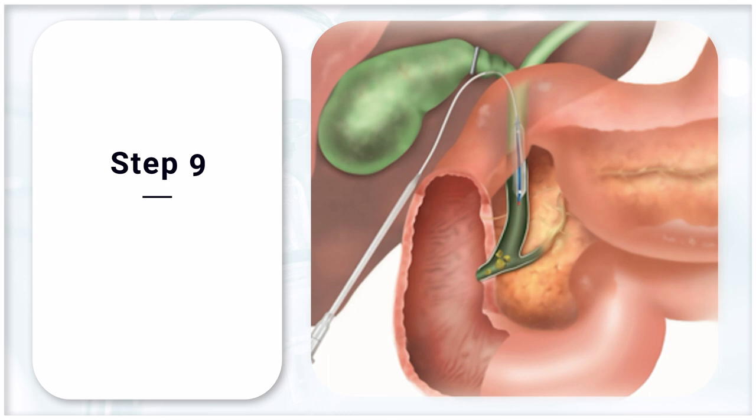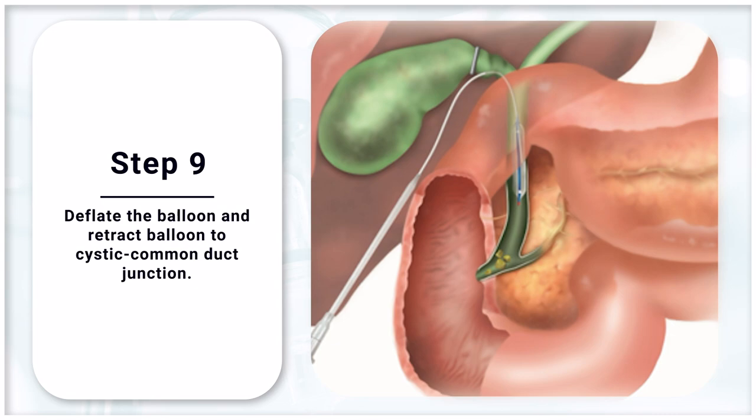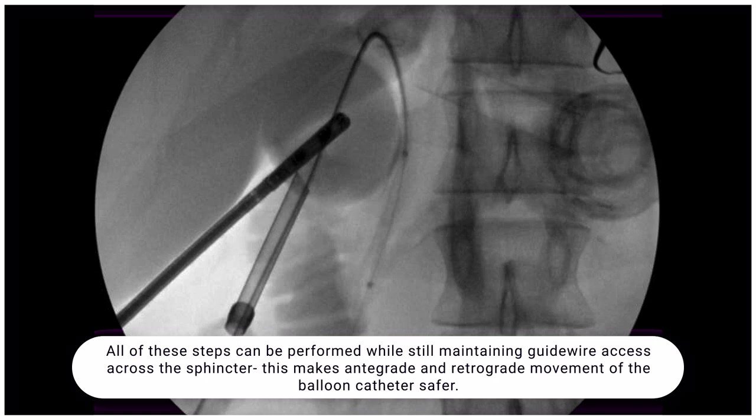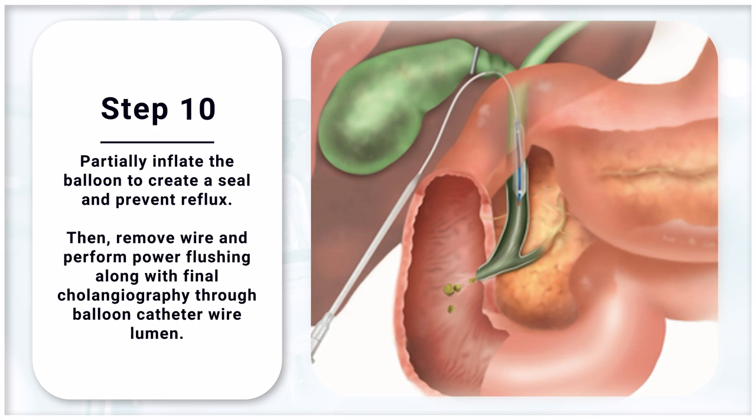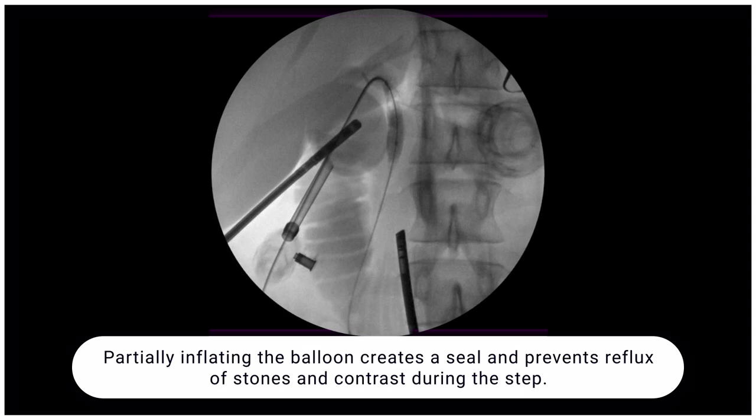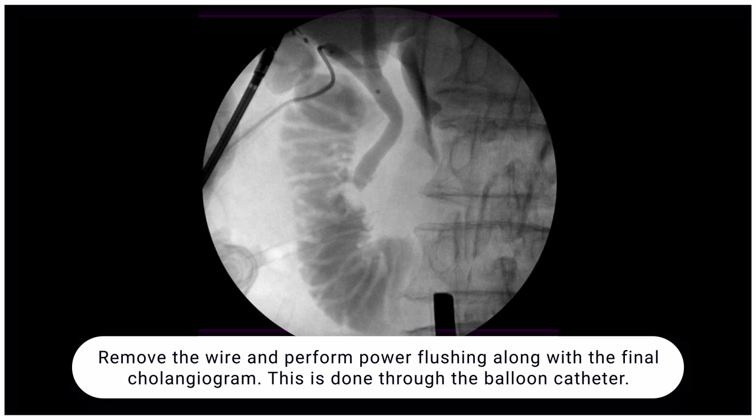Step 9: Deflate the balloon and retract it to the cystic common duct junction. All these steps can be performed while still maintaining glide wire access across the sphincter, making antegrade and retrograde movement of the balloon catheter safer and easier. Step 10: Partially inflate the balloon to create just apposition between the balloon and the wall of the duct. This creates a seal and prevents reflux of stones and contrast. Then remove the wire and perform power flushing along with a final cholangiogram through the balloon catheter.